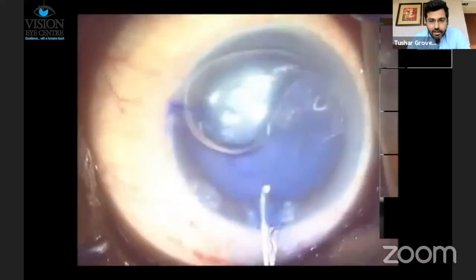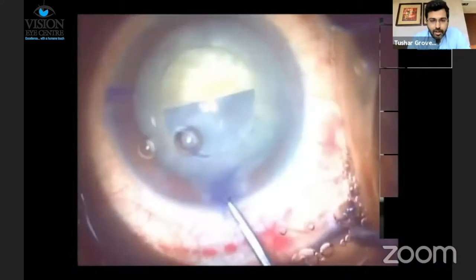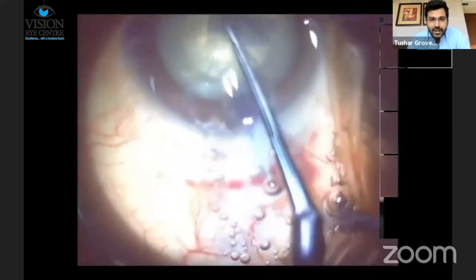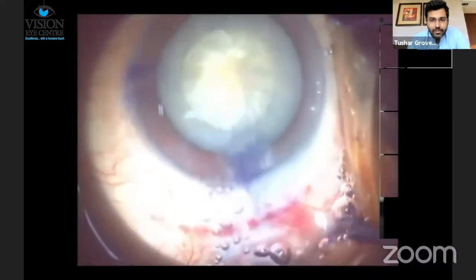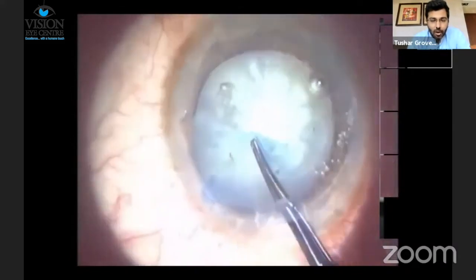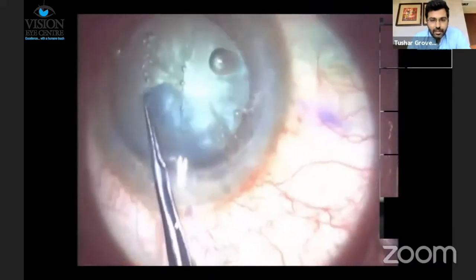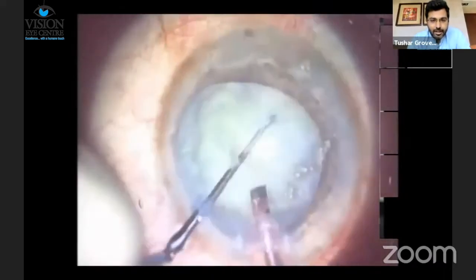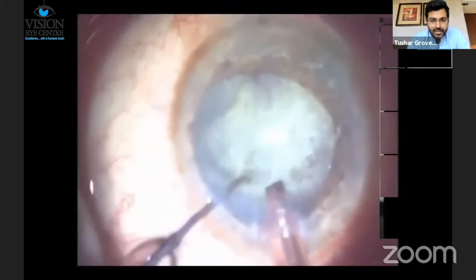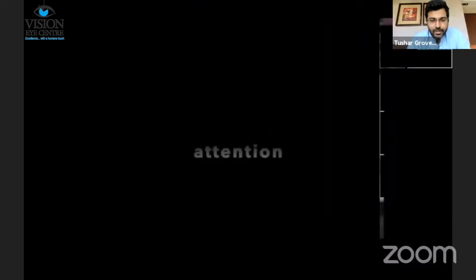That's why it's important to stain white mature cataract cases even in femtocapsulotomy. Sometimes you have what looks like a complete rhexis, but if you look carefully there is an uncut area of about two clock hours, and if you were not careful this could have gone peripherally. In cases with about six clock hours of uncut capsulotomy, we did manage to get a manual capsulorhexis, but as soon as we performed nuclear segmentation we realized the anterior capsule had gone posteriorly, resulting in a large posterior capsular tear with drop of contents.